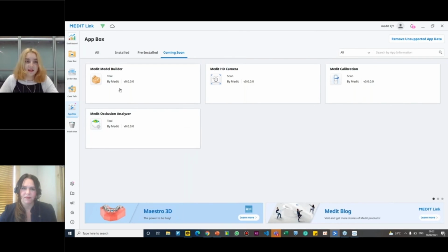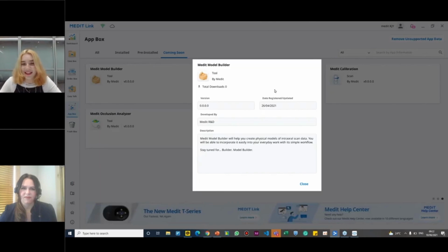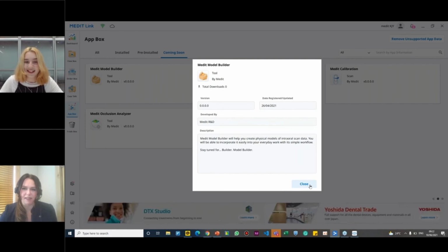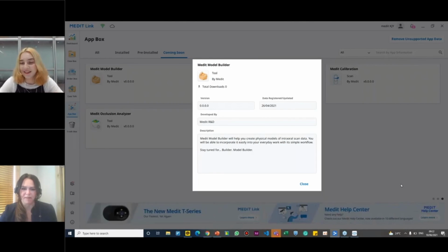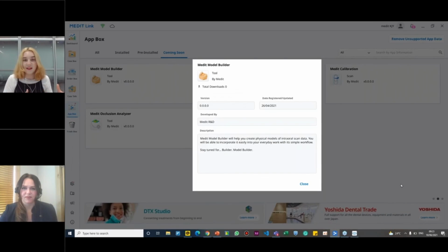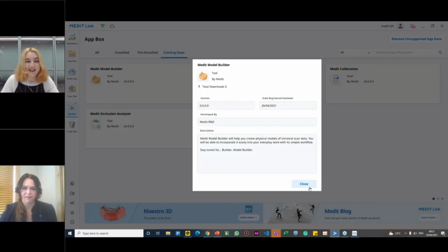And I think that this summer you will enjoy our Medit Model Builder, which is coming in July, I think the middle of July. Hopefully you enjoy it. You did a demonstration for me, and it's pretty cool. You guys have got some good stuff coming down the pipeline, so I'm excited for everyone else to see it. Yeah, one thing I can say is that it's really simple. You've never had a simpler workflow when it comes to building a model, and hopefully everybody can enjoy it. And as usual, it's free for anybody who has a MeditLink account. So I'm very excited as well.